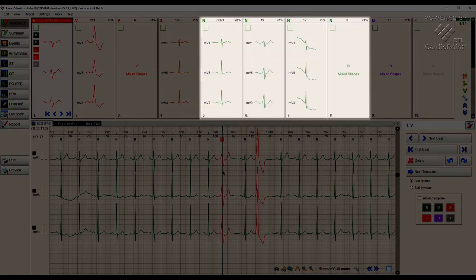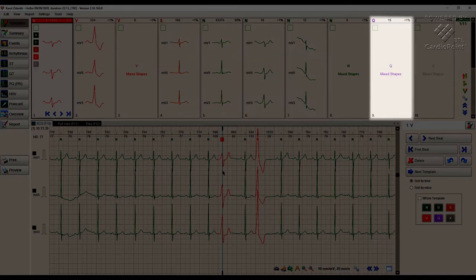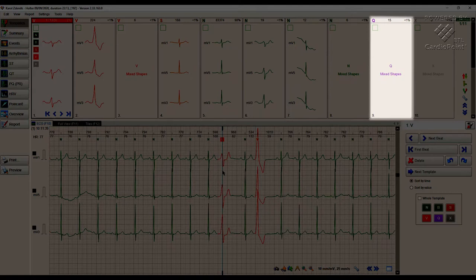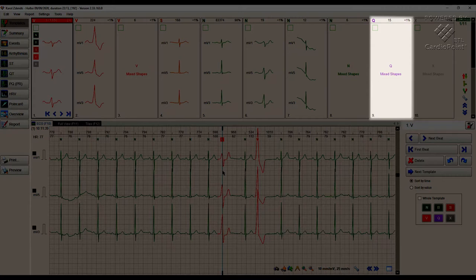We can also see the Q template. This group contains all the beats which the program cannot automatically assign to a specific type of morphology.